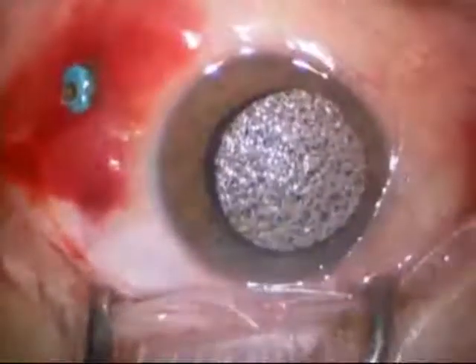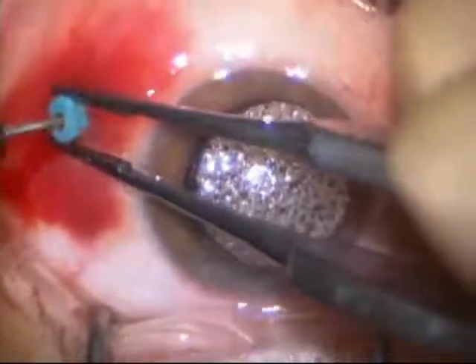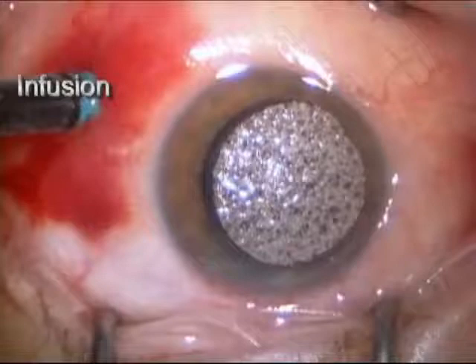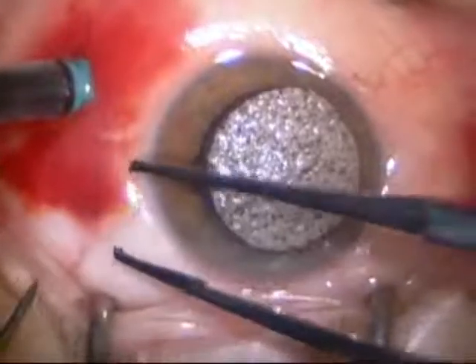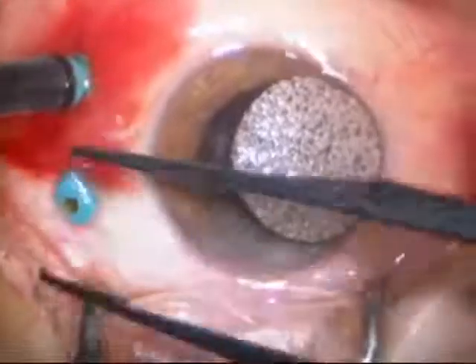This surgery is being done using a 25-gauge small incision vitrectomy system. What you're seeing on the top left is the infusion being placed through a very small 25-gauge trocar. After the infusion is in place and running, two more trocars will be placed. These little blue trocars are used to insert instruments in the eye during the course of the procedure.